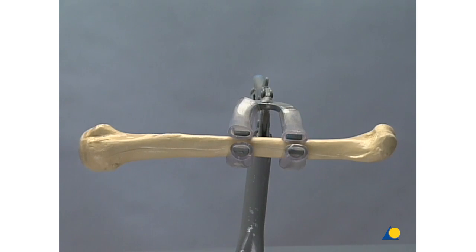Simulating the supine position, we will fix the humerus model in the clamp with the dorsal surface downward.